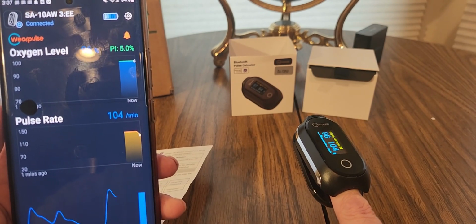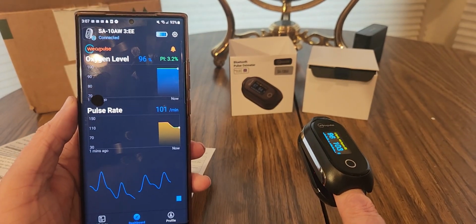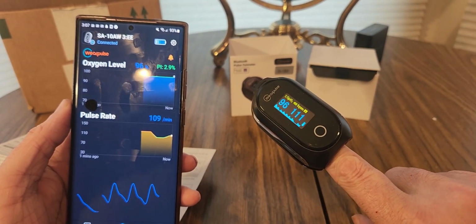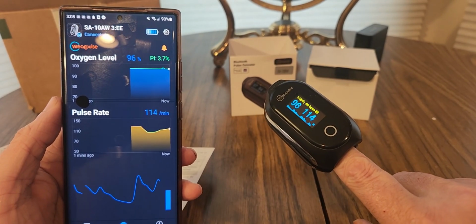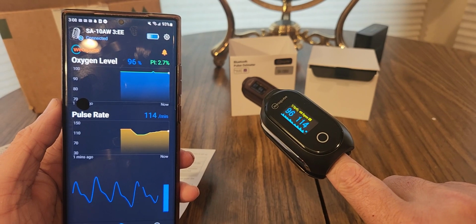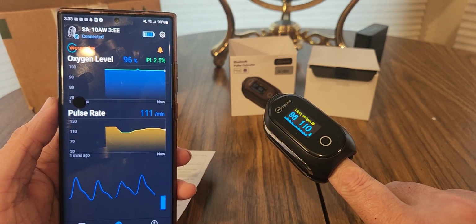Give it a few seconds. Trying to remain calm and steady. It's kind of hard for me to do while recording. I think I'm alright. This is really cool. There's my pulse rate down in the middle, 114. Oxygen, 96%. I think that's good. I think it's going to beep once it's off.